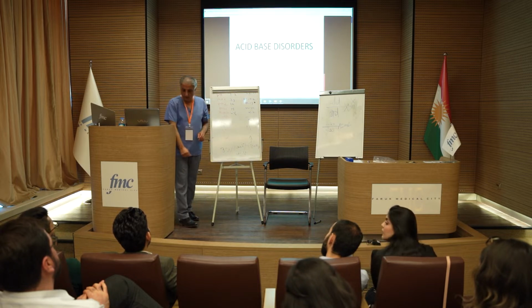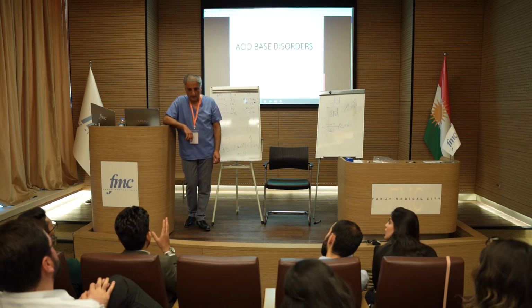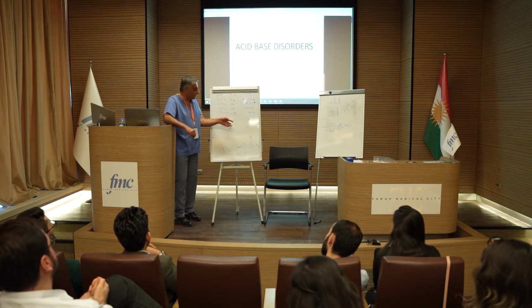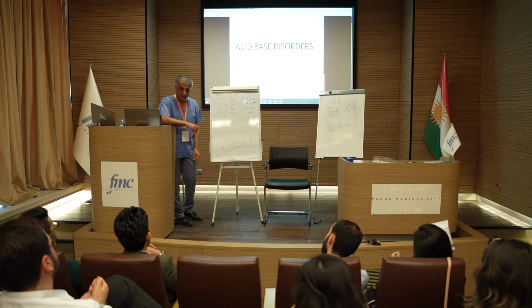Can that picture explain DKA? Yeah, the same thing. But then you ask another question: what's the lactate? What's the blood sugar? Where's the acid coming from?